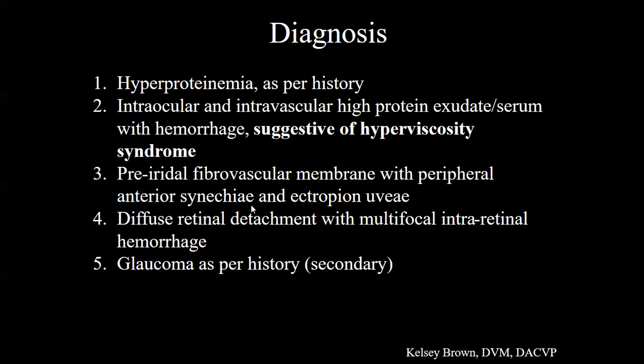So for some reason one eye goes bad first. The impetus for enucleation is usually development of glaucoma, right? So if I have to bet, I would say the other eye might have similar lesions, but not as extensive as this one, and not enough to have caused glaucoma yet. That's why this one was enucleated first.